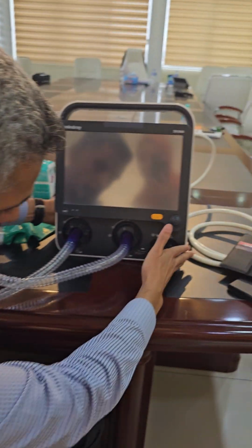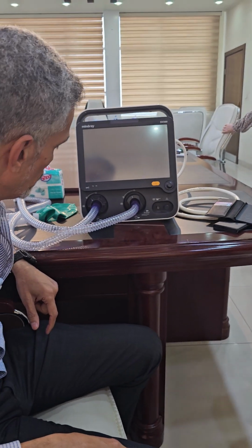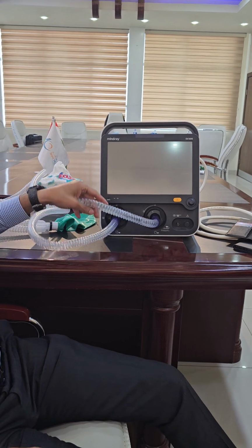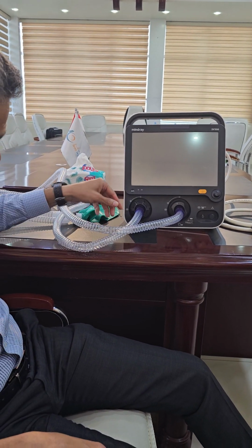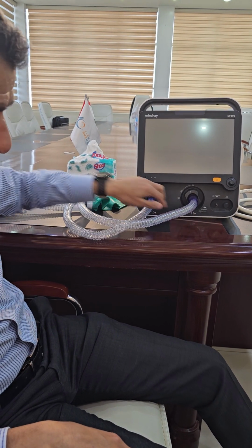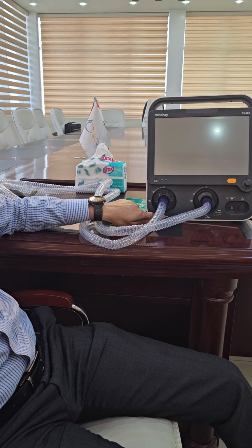Now we're looking at the front. So we have 2 ports. You can see, this limb should be going to the patient, and this is coming from the patient.